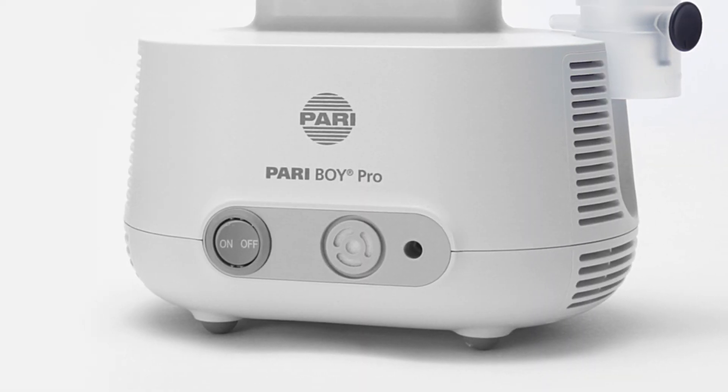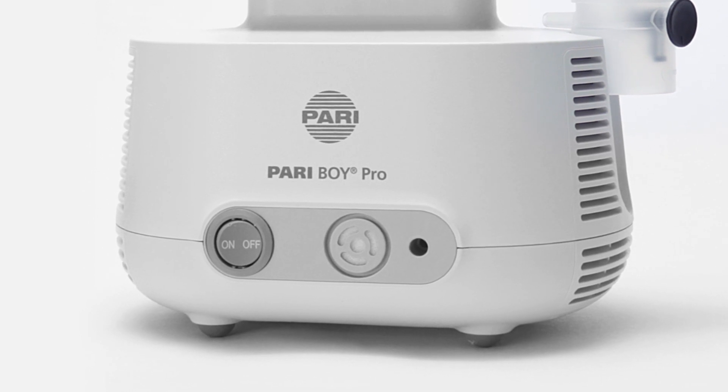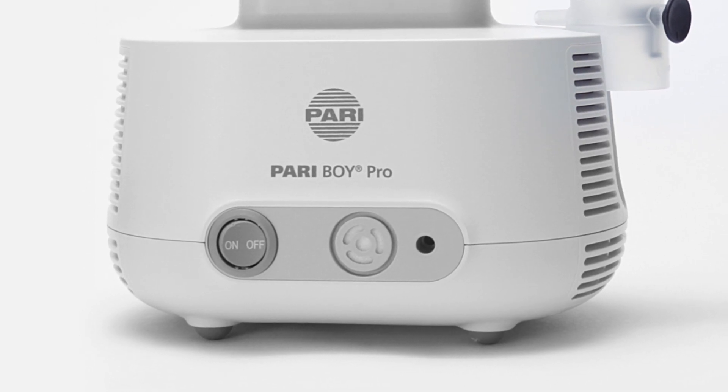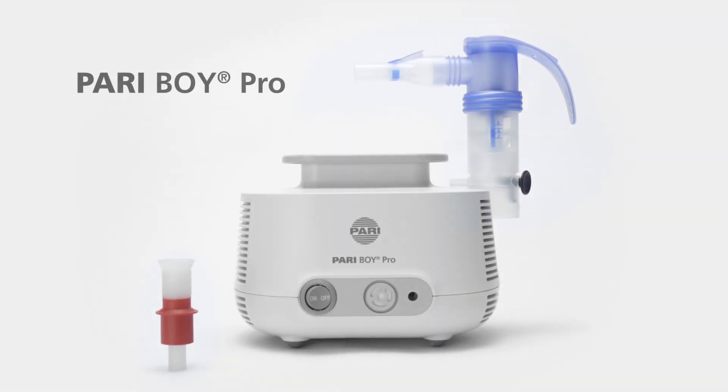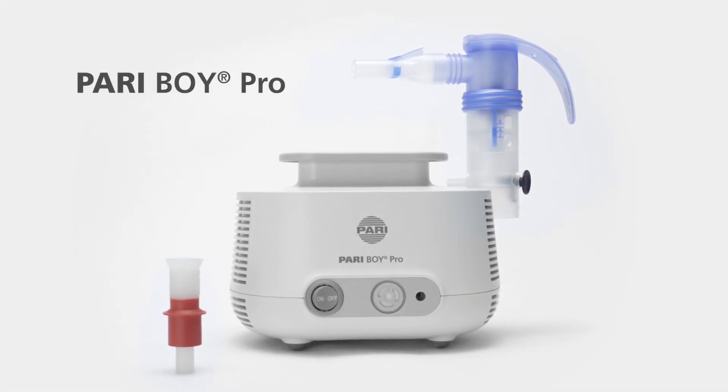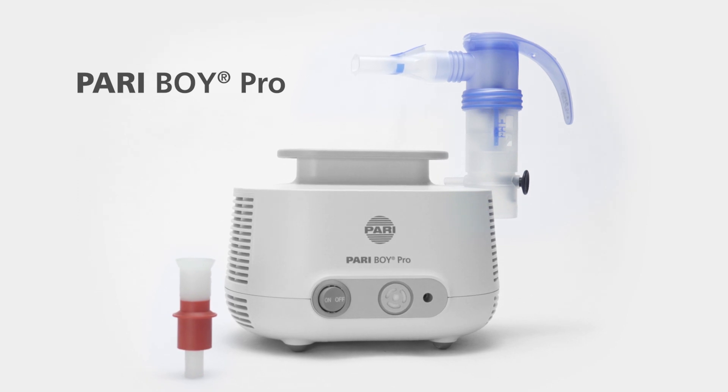Pariboy Pro is a nebulizer device for adults and children aged 4 years and older, for use in chronic and severe diseases of the lower airways such as chronic bronchitis, COPD, cystic fibrosis and asthma.